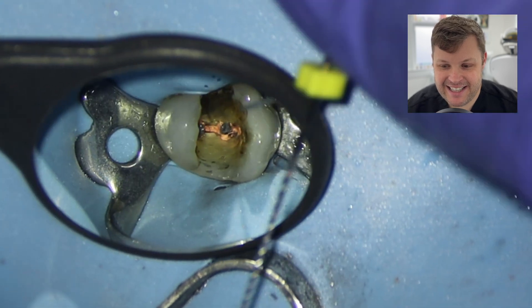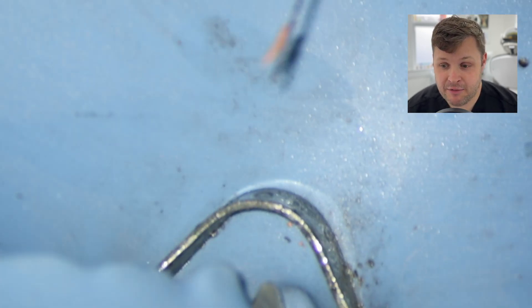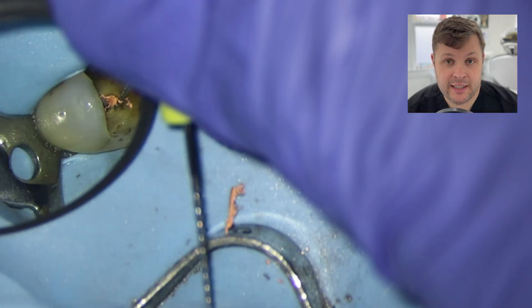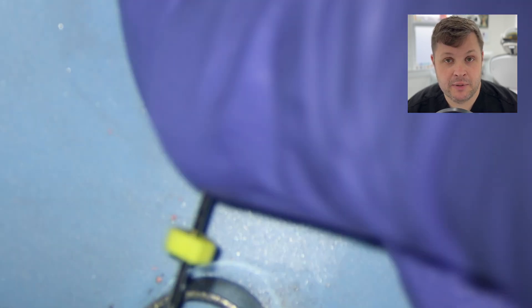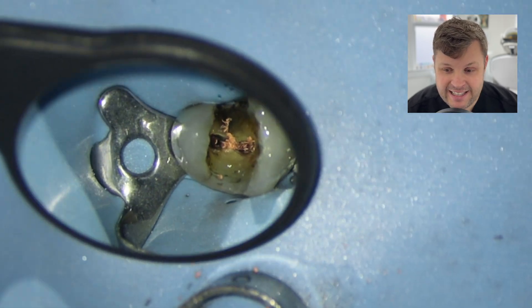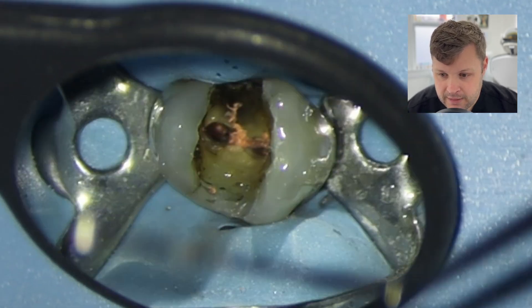Thermophil carriers are a bit of a double-edged sword — sometimes they're easy to remove because they're solid pieces of plastic, and sometimes they can be difficult. The way I'm going to remove these is using an H-file with a twist-and-pull technique. I don't like to use a rotary here because it churns up the GP and the plastic carrier, making removal much harder. As you can see, it comes out nicely in one piece.